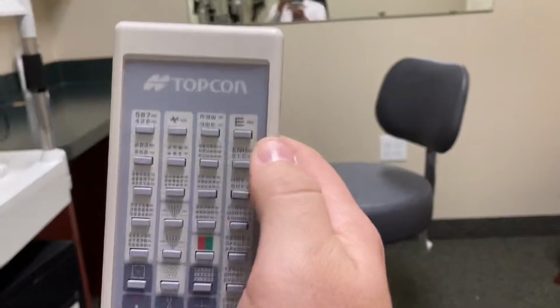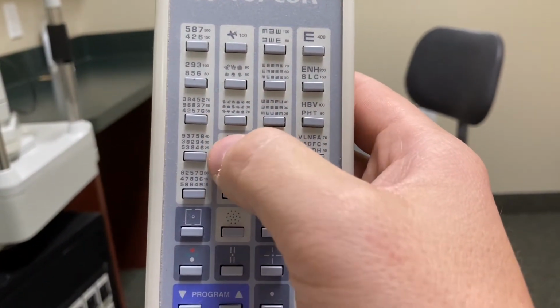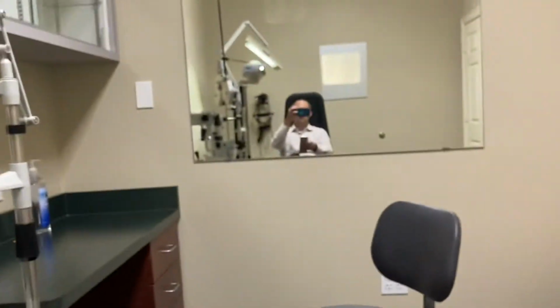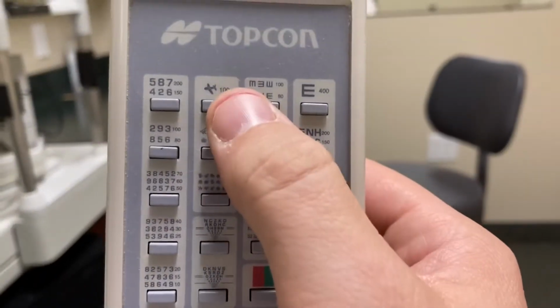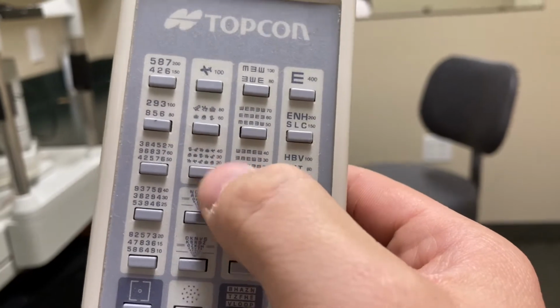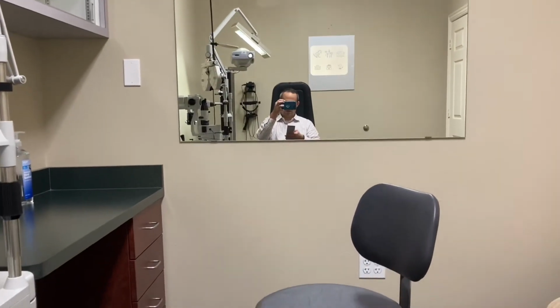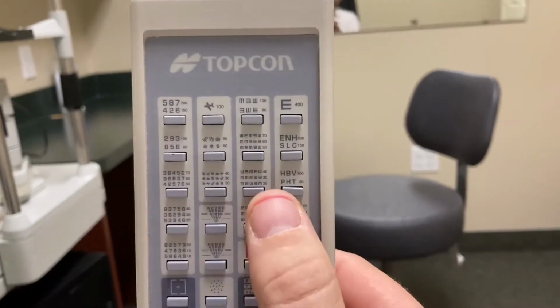There we go. So you can go down through number charts down to 40, 30, 25, 20, 15, 10, which is too small to see. There we go. And then they've also got the pediatric symbols, which is just the little kid shapes. Let's pull that up.